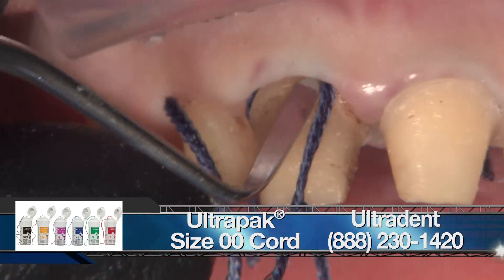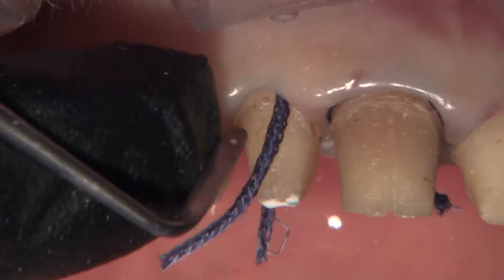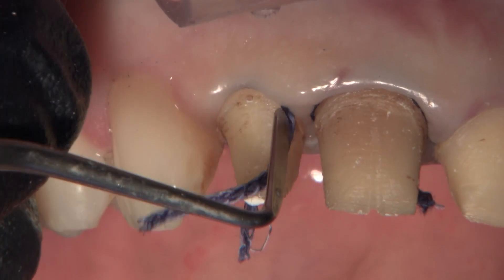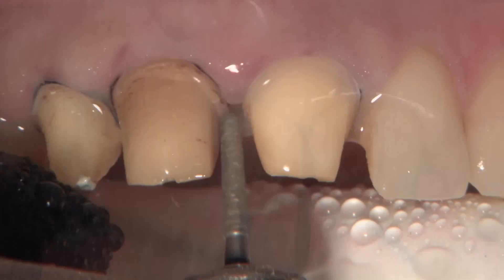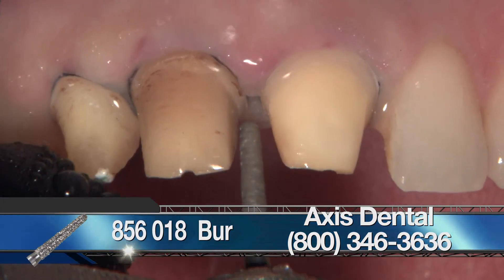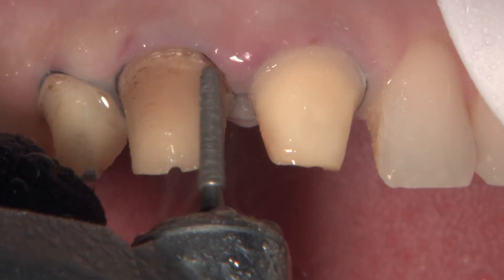I have a pretty hard and fast rule about not taking an impression the same day I prep when I'm prepping multiple anterior crowns, because I want to see how the tissue is going to react to the bio temps and make sure we don't blunt any papilla. Unfortunately, we don't have many papilla here to even blunt, but I'm putting the cord in anyway to get about half to two thirds of a millimeter of retraction. Then I'm using my 856-018 bur to go in and smooth around the margin.